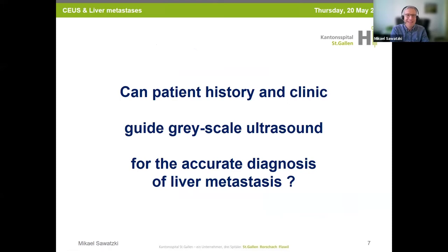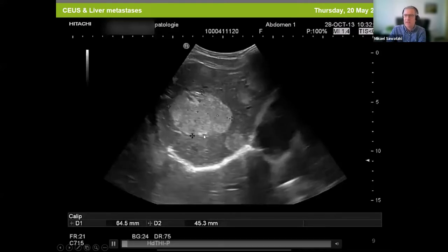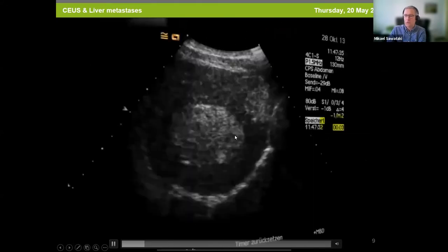So that's the answer to my question: can patient history and clinical context guide grayscale ultrasound for the accurate diagnosis of liver metastasis? I think the answer is no. This is a 60-year-old female patient, asymptomatic with no risk factors, showing a hypoechogenic liver lesion and other liver lesions — of course it could be hemangiomatosis.